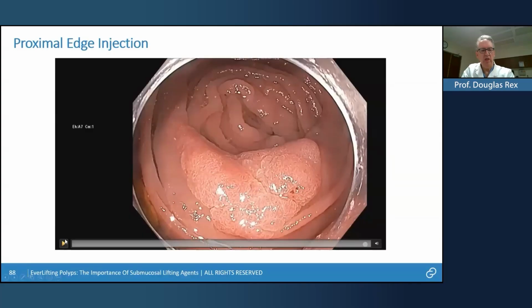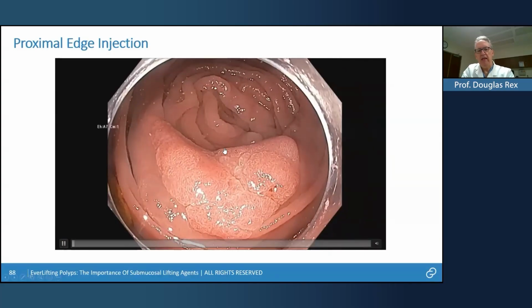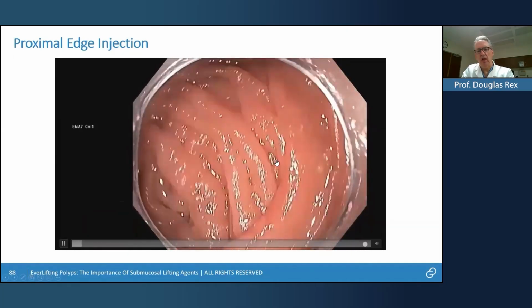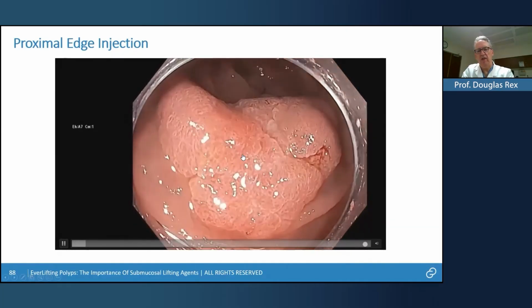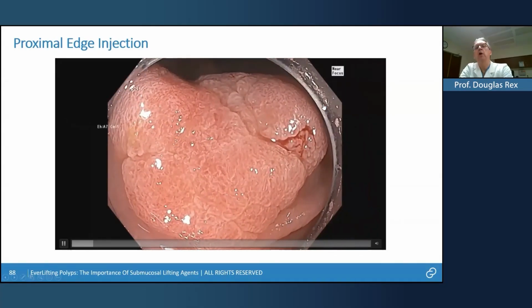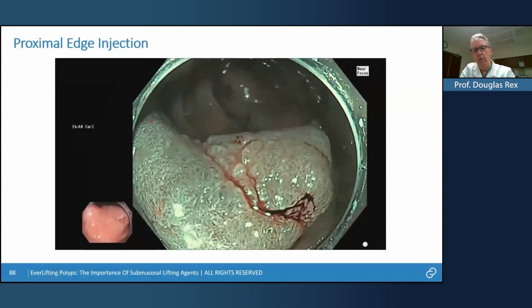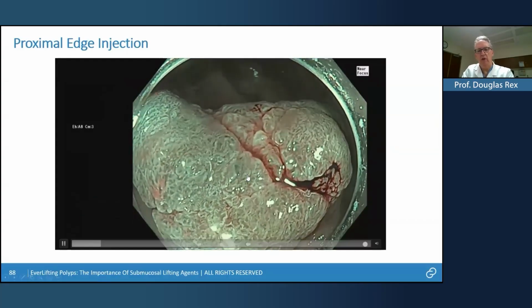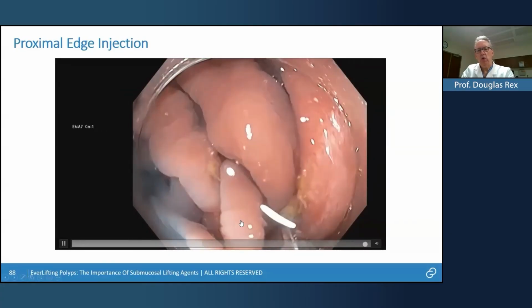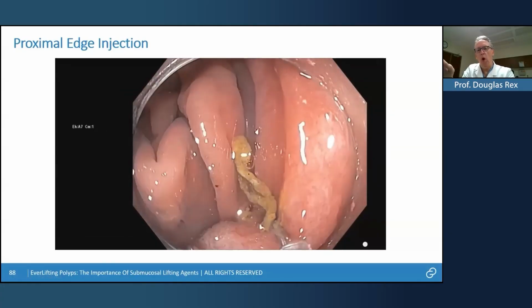This is a lesion that's down in the cecum. And again, you can see that it doesn't look perhaps like there's a lot of lesion that's on the other side of this little fold down in the cecum. But again, you should never underestimate how much polyp may be over there. So I tried several different tricks, ultimately sort of started injecting at one end of it.